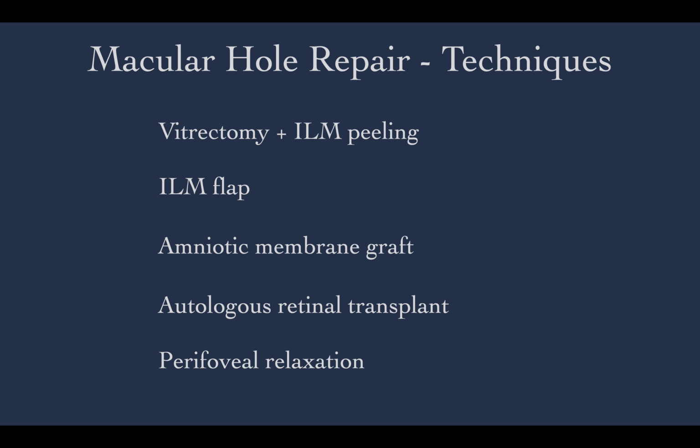Autologous retinal transplantation for closure of refractory macular hole may work in up to 90% of the eyes. In eyes with anatomic closure, visual acuity improves in about half of the patients.